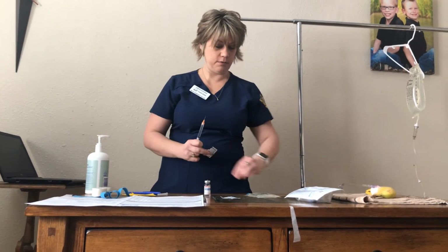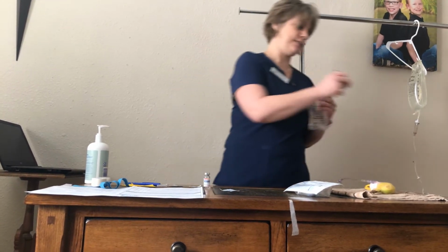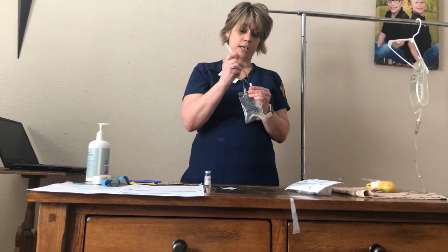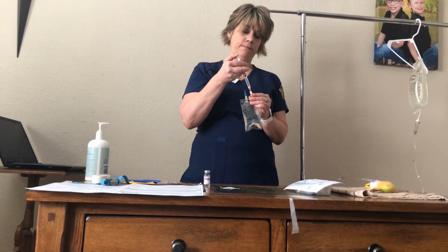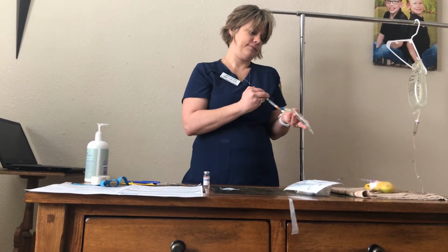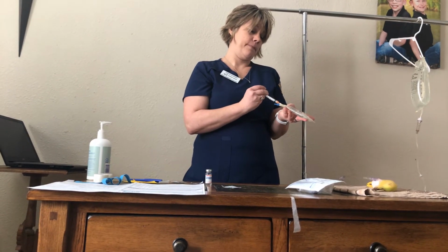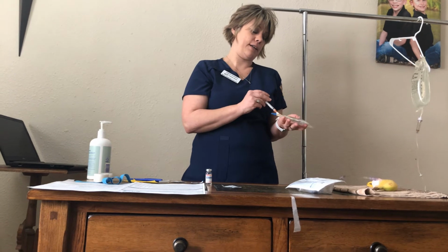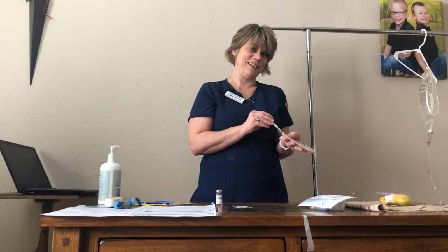And I'm going to alcohol swab my piggyback. I'm going to go ahead and inject the medicine into the bag. Oh, that didn't tap. And I did pre-check the bag to make sure that the expiration date was August of 21 and there was no discoloration. I'm going to put that in my sharps container.